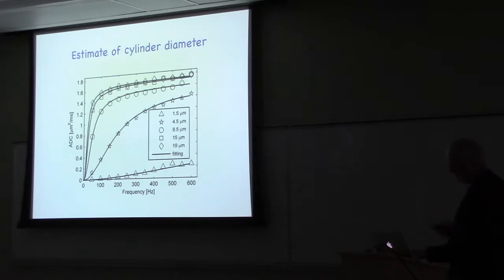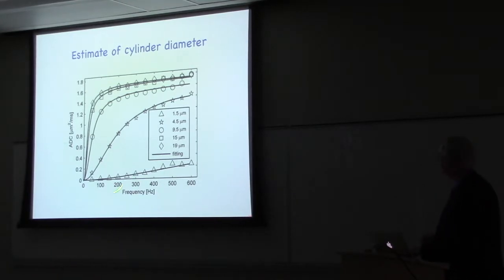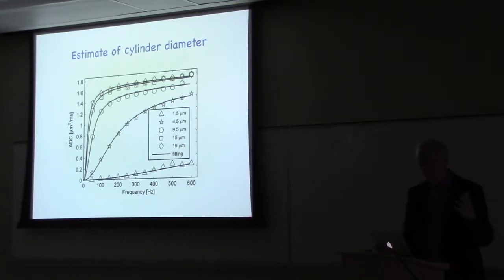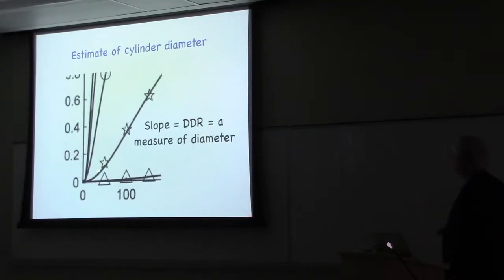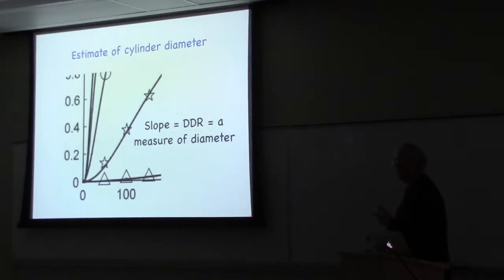If I go back to this curve though, and I look at these dimensions, these are the dimensions of a lot of interesting structures in biology. And if I look at this region down here, the region down here is much easier to achieve on things like human scanners. This whole region is achievable on a small animal scanner, but there are some other issues that go into humans because of gradient power, etc. But if I just blow that area up, I see the following, which is I have things that look pretty much like straight lines, right? And the difference between these straight lines is the gradient, and the gradient varies with the size of the cylinder.